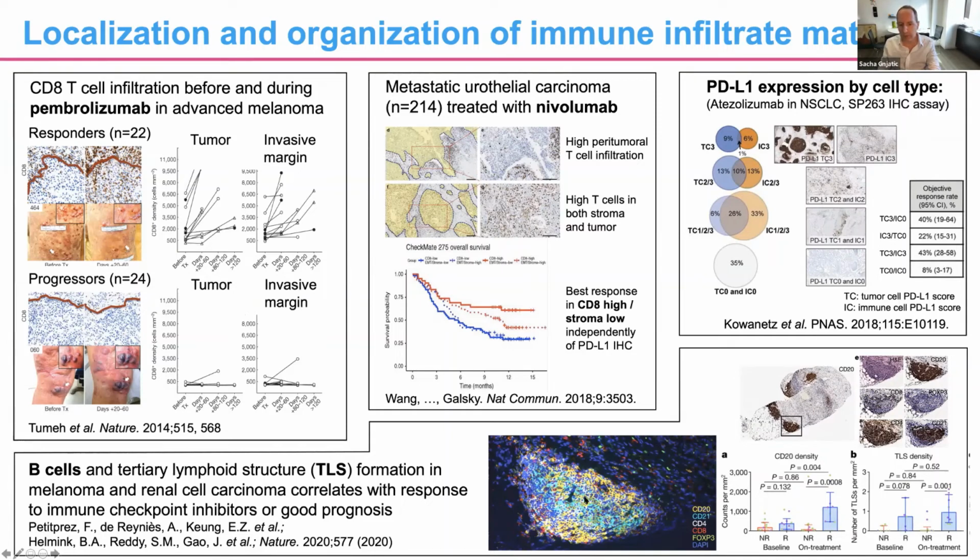So organization of these type of structures and quantification cannot really be done easily with single markers in immunohistochemistry, because you would end up using too much tissue. And this is why we all proposed, as part of our CIMACs, to introduce multiplex immunostaining as part of our protocol, to be able to see many markers at a time with a sample-sparing method.